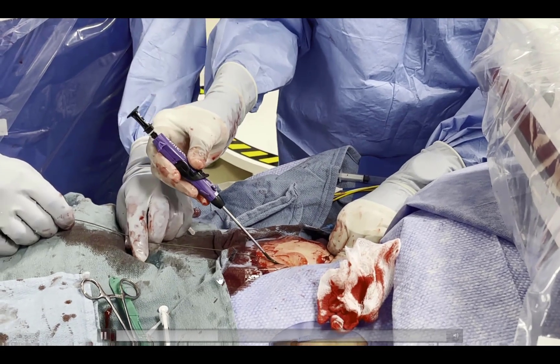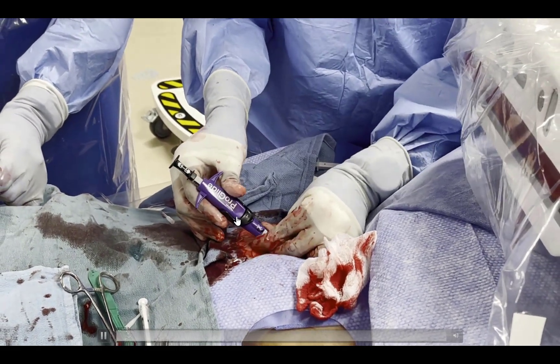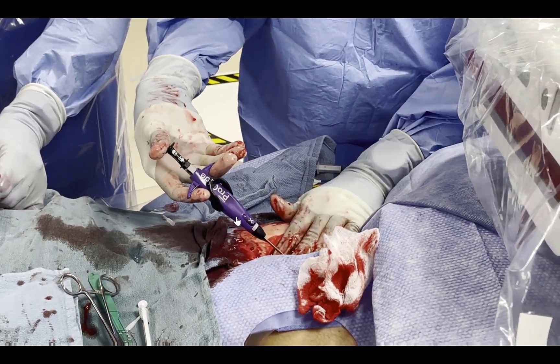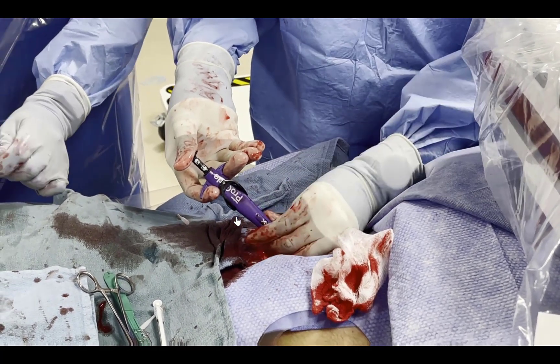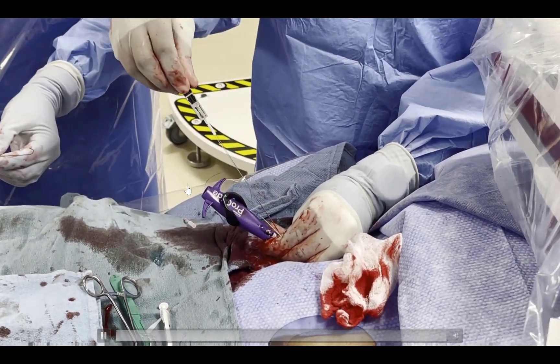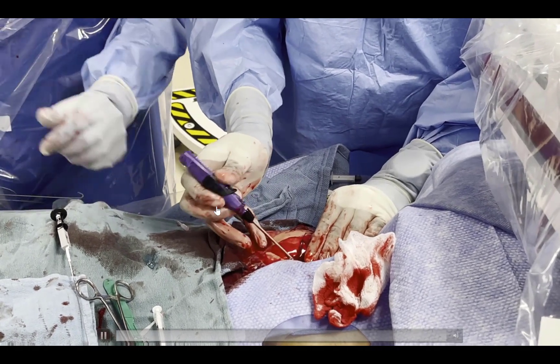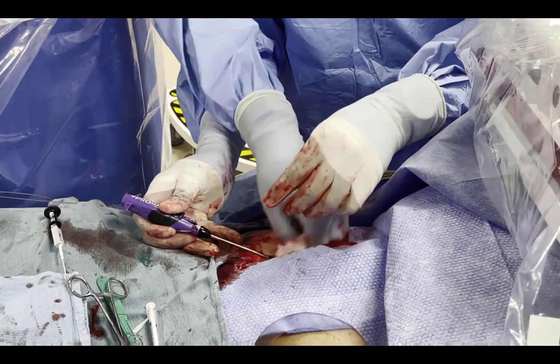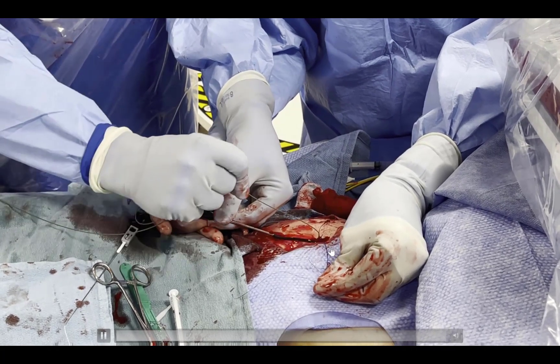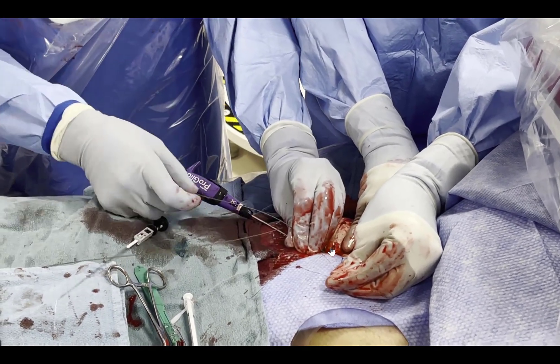Now the second device is inserted. Similar to before, the wire is removed, the device is inserted, and there is good blood flow. The device is rotated to approximately 2 o'clock, the foot is pulled back, and the second suture is deployed in a slightly different orientation than the first. The suture is cut, and we now have two sutures across the arteriotomy. The foot is placed down and the device is removed.